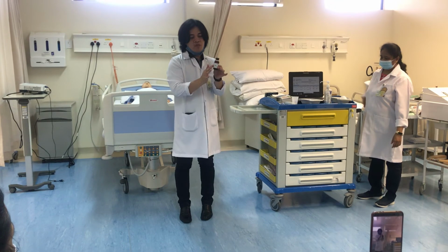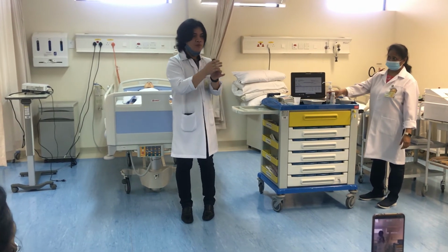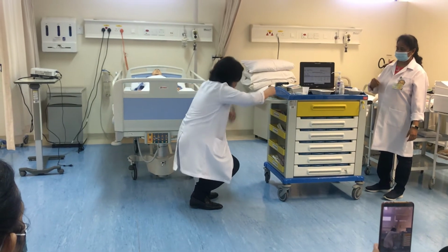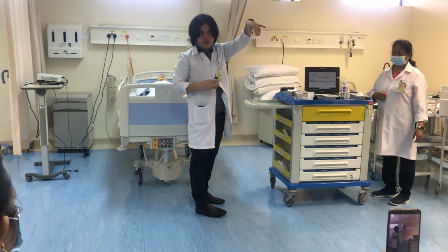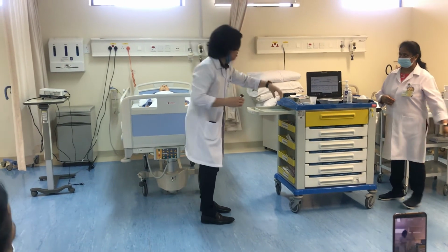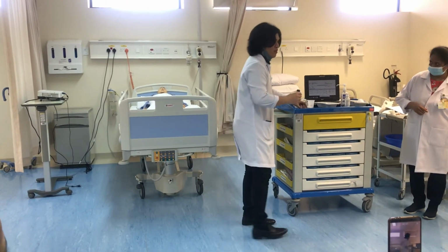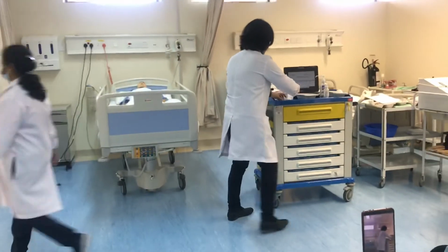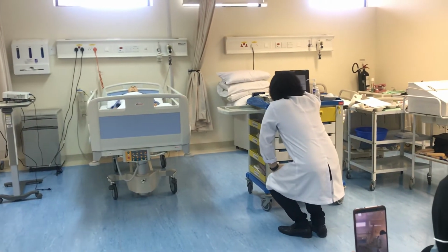So the label should be here facing the palm. Okay? And with the eye level, teach them that this is calibrated. There's ml, there's cc, there's teaspoon, and so on. Yeah, my back will break. Like that. My God. That's fine. Okay?